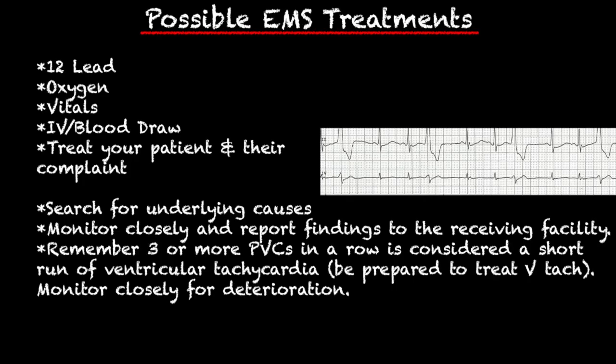Before we go into the possible EMS treatments, I just want to point out on this strip right here — you'll notice that there's a PVC every third beat, and that's actually called trigeminy. We'll go into that in the future in a separate video.